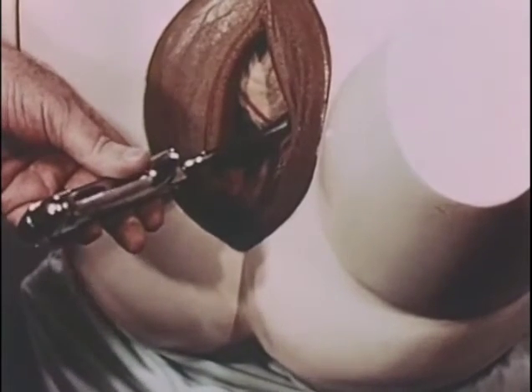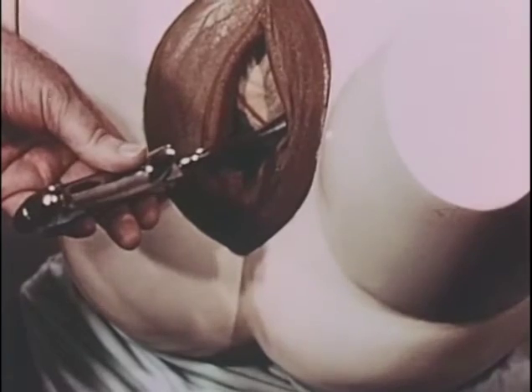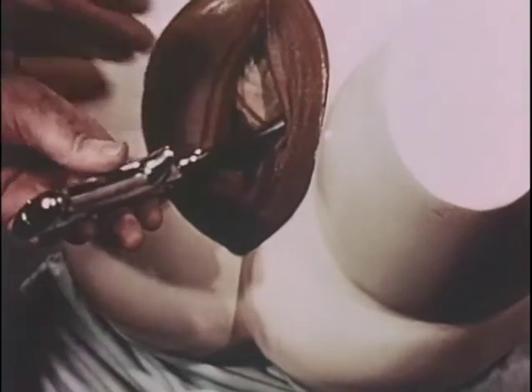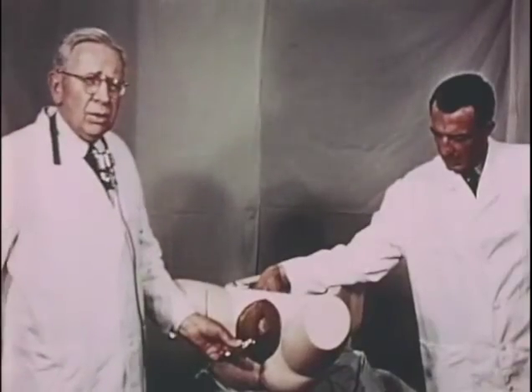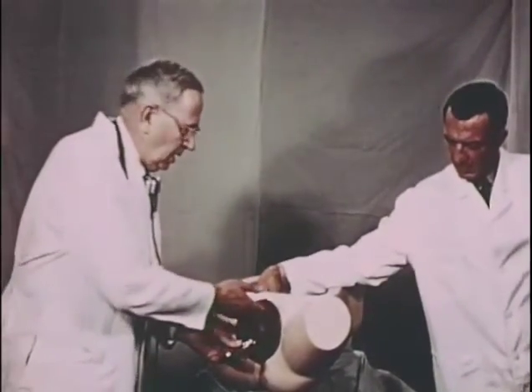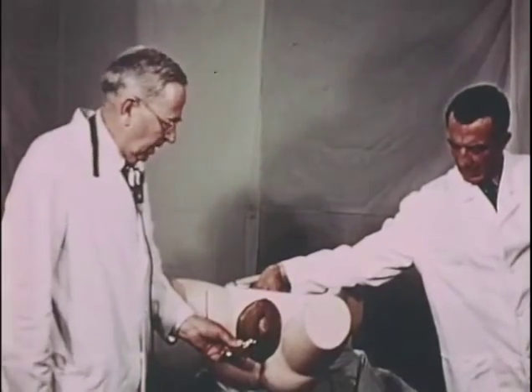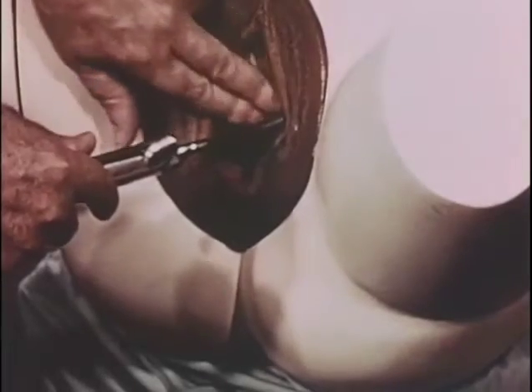However, we feel that as a disadvantage, it is far outweighed by the advantage of having the posterior blade in place originally to prevent backward rotation of the occiput during the application of the anterior blade. After locking, the application is checked.